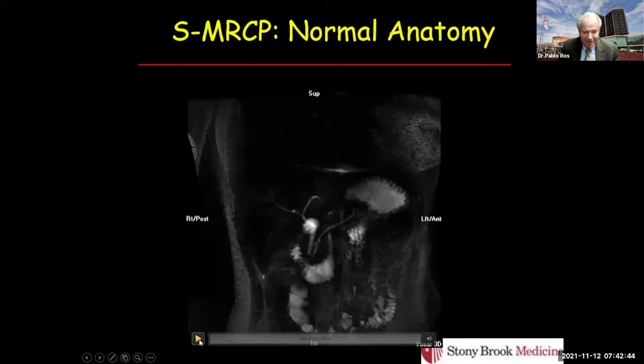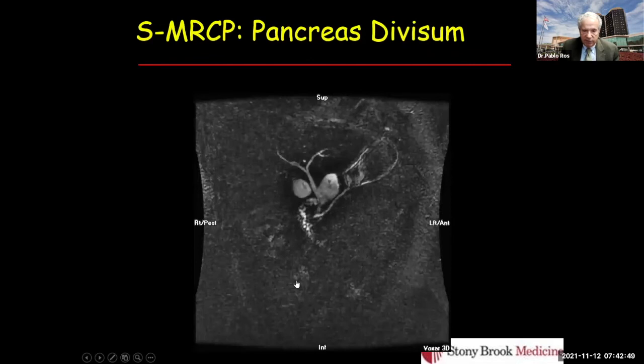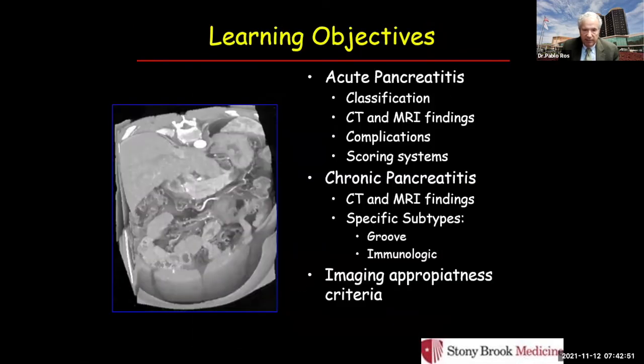It worked with me, but maybe it doesn't want to work. But you will see here the increased secretion in the dynamic MRI. About to finish, 2 minutes to go.